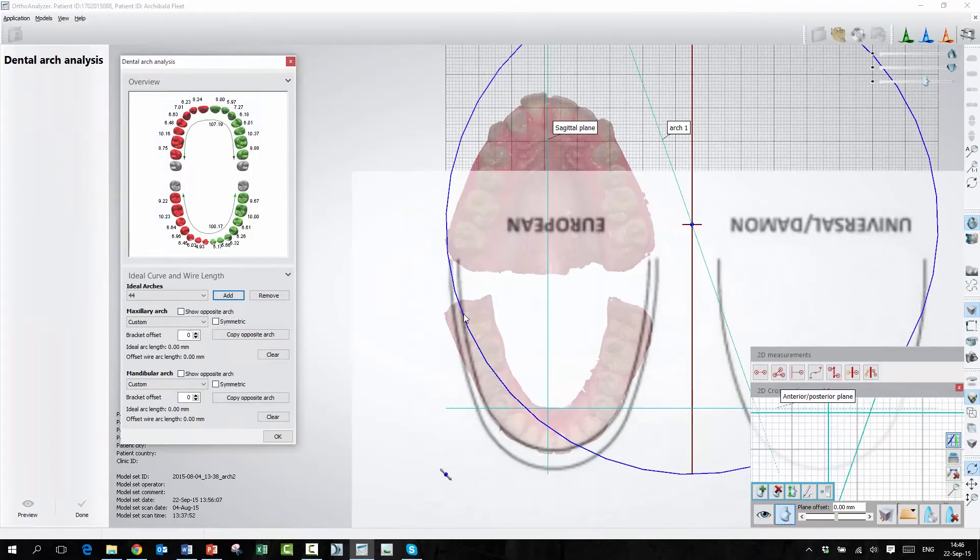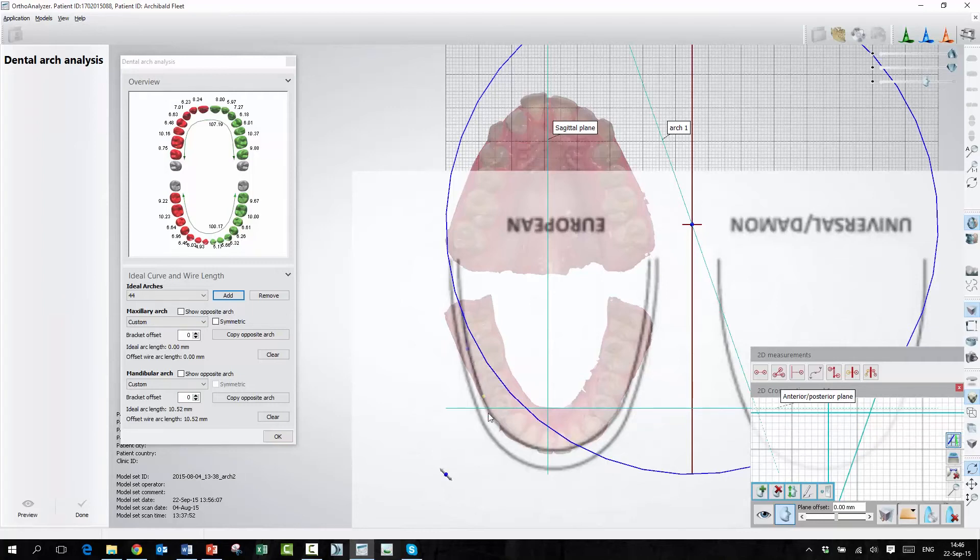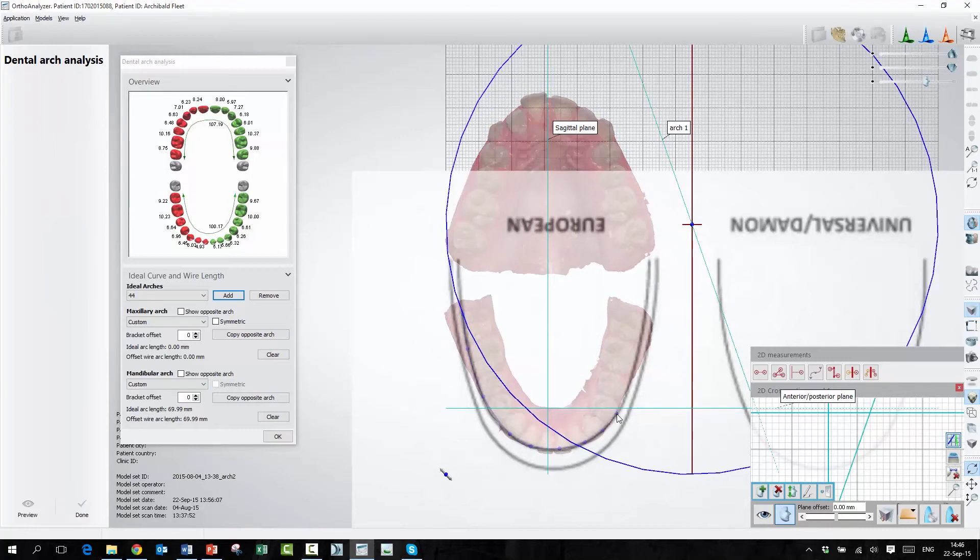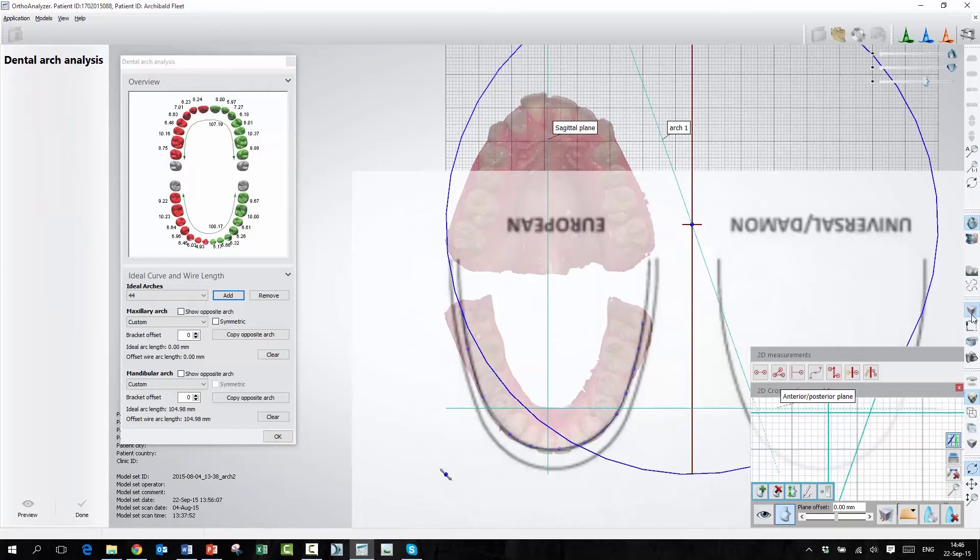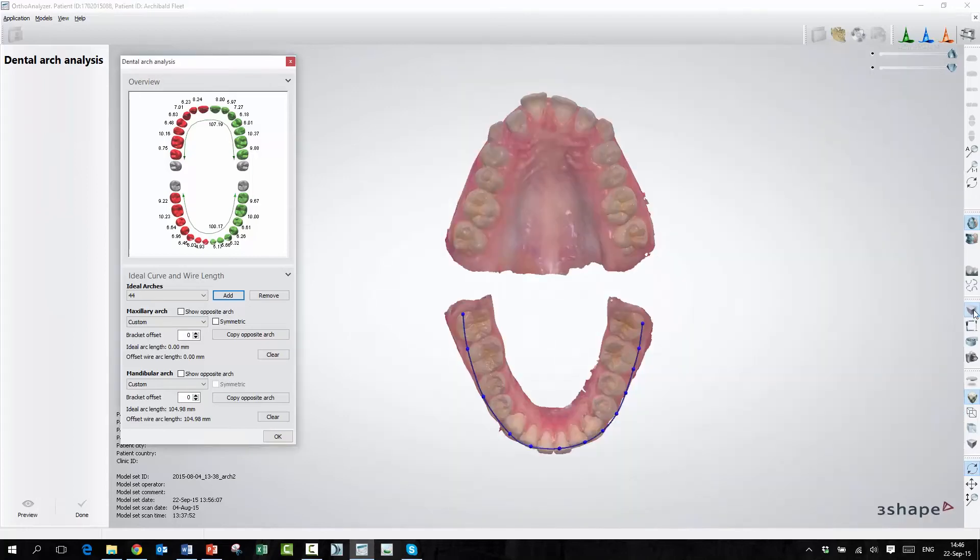So I'm going to press Add, and then I'm going to draw on this line here to find the right arch. And I'm using the customized arch, but not symmetric. So this is just a line I will find here.